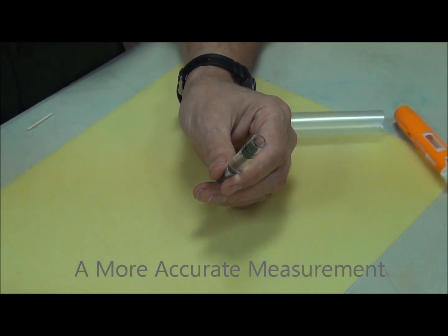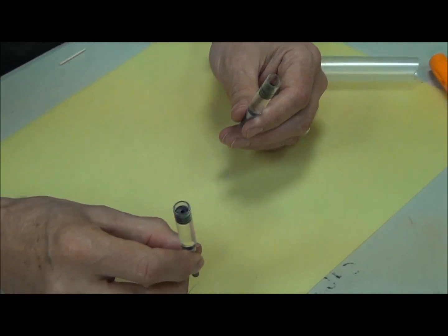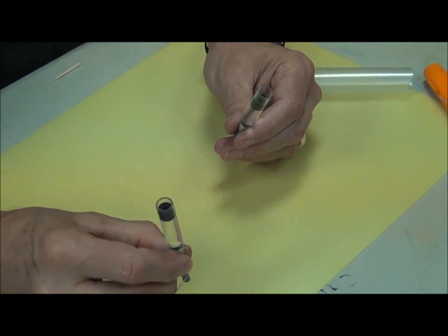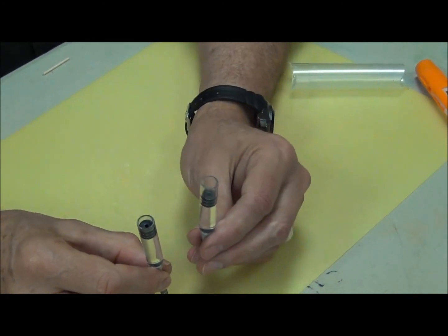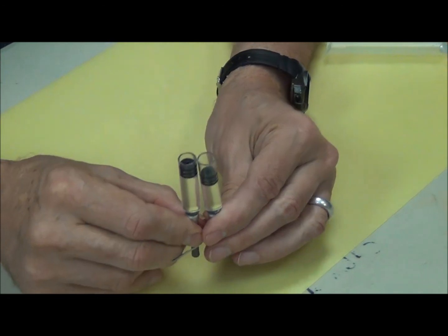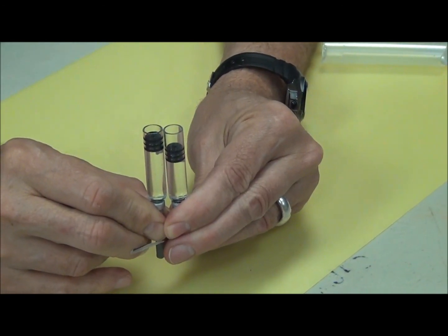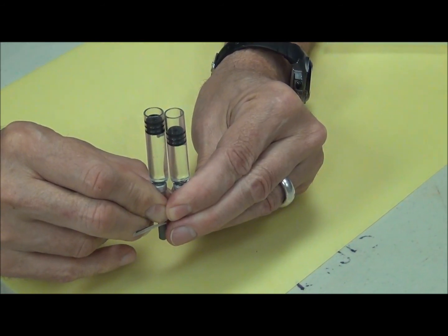We were experimenting with these different syringes, and we took this one out before we engaged it like we would have given it a shot. So this has been an unused epinephrine carpule. This is the one we just demonstrated. If we line them up, you can see how far the plunger's moved for one dose of epinephrine. You want to move the plunger the same distance for each additional dose of epinephrine if it's needed.